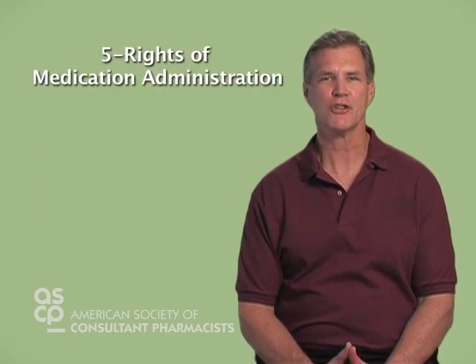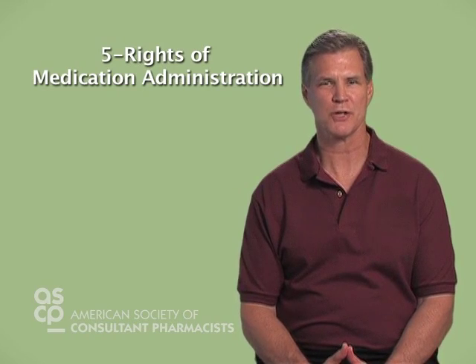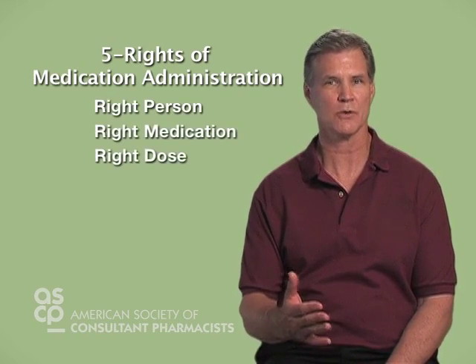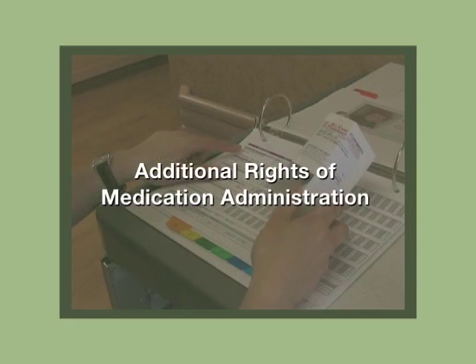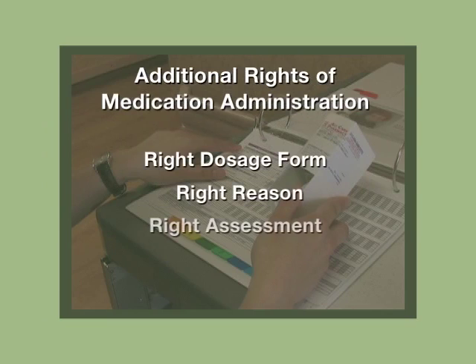As with all medication delivery procedures, we start with the basics. The 5 rights of medication administration: right person, right medication, right dose, right time, and right route. There are multiple steps to proper administration. Some organizations may choose to emphasize 6, 7, or more rights of administration instead of 5. For simplicity's sake, this video will stress the 5 basic rights, while covering other important aspects of medication administration, such as administering the right dosage form, giving the medication for the right reason, conducting the right assessment, and performing the documentation in the MAR.